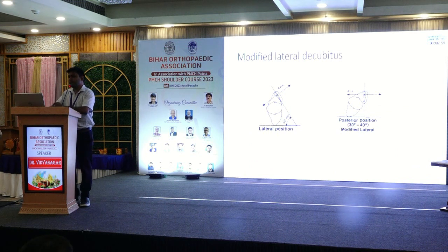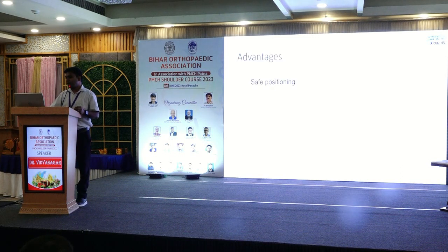So what happens with this position? There are a few advantages of this. The inferior glenoid labrum becomes more visualized. Coming to the advantage of the decubitus position, it is safe positioning. And in the beach chair position, there are a few complications that may occur, which will be discussed later on.